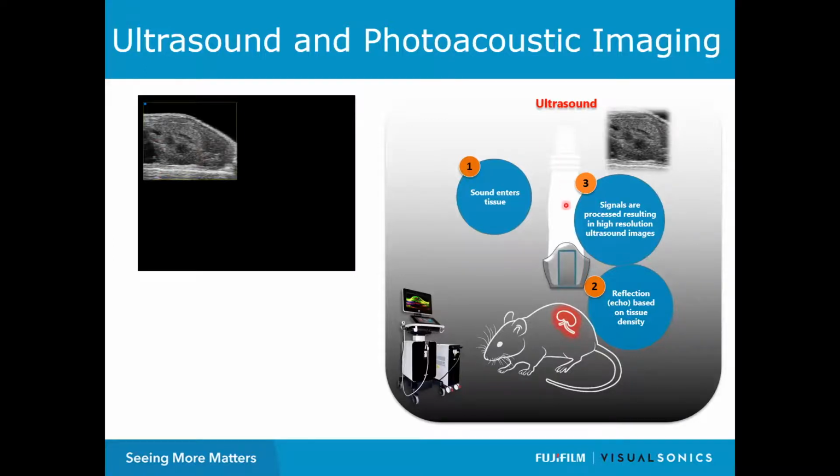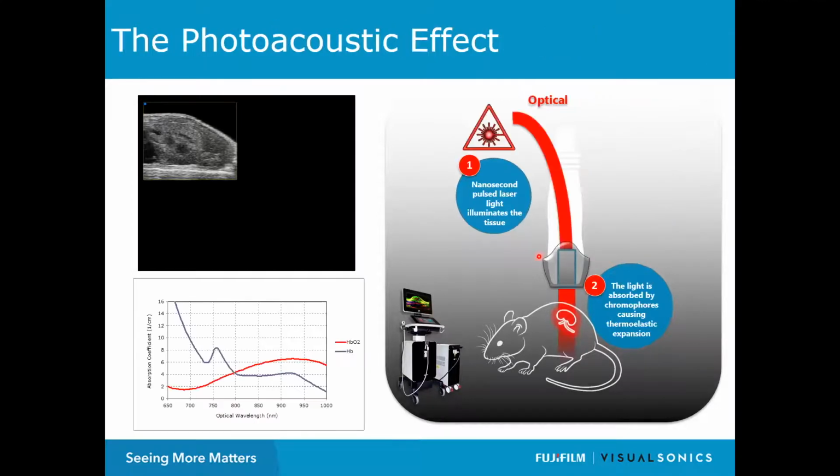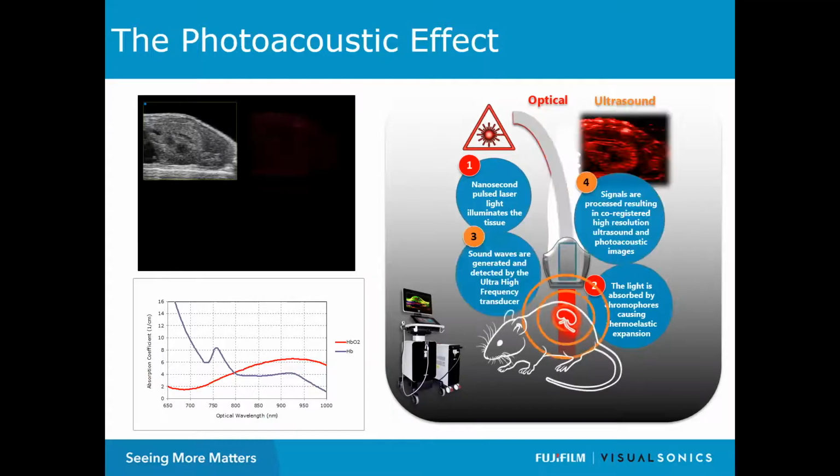Now, by having this dedicated transducer, you can modify it and attach fiber optic cables for laser light. It's pulsed laser, it's safe, it's diagnostic, not therapeutic. By using laser pulses, nanosecond pulses, you can then use optical properties of the tissue. Andreas had some of the photoacoustics examples from his side already in the presentation. Based on the absorbance, a sound wave is created that this transducer is detecting. In that case, the red signal represents blood. So this is the kidney blood content.